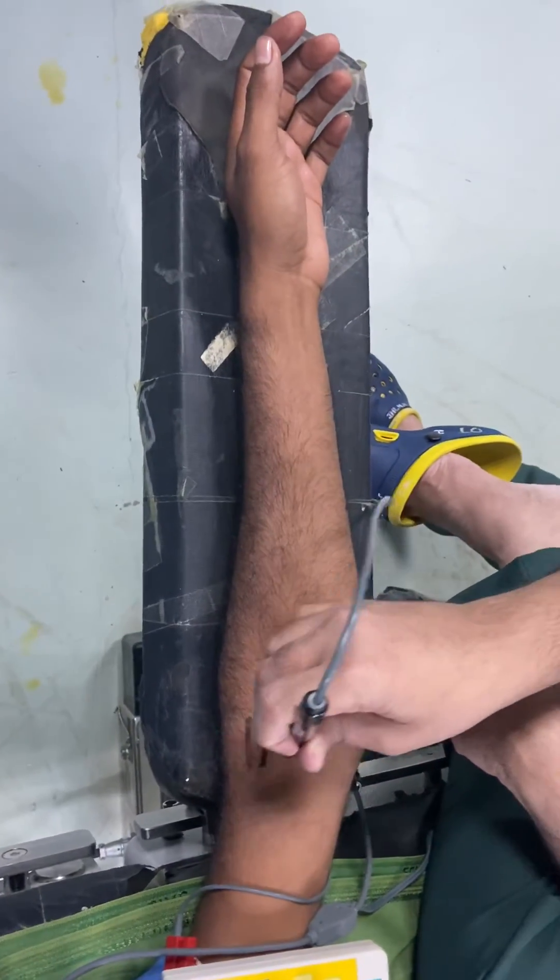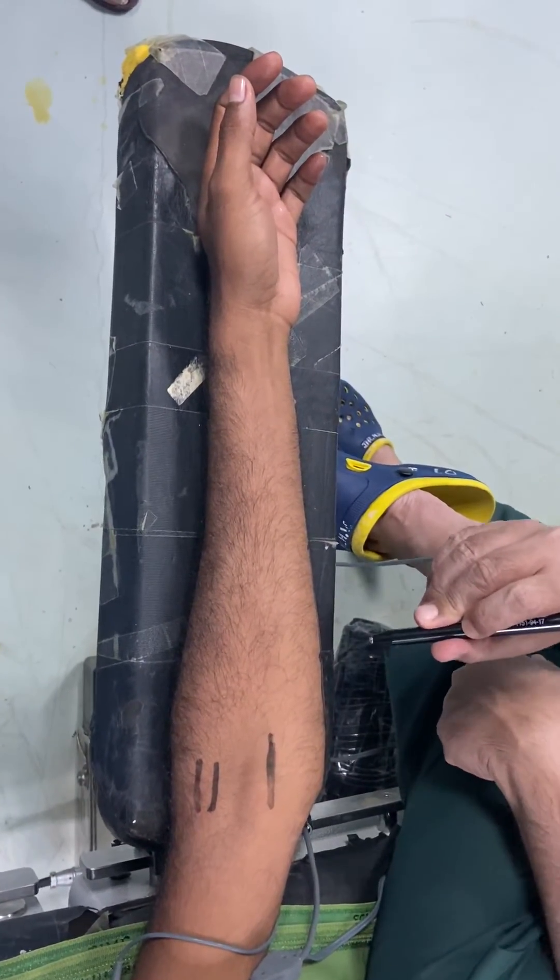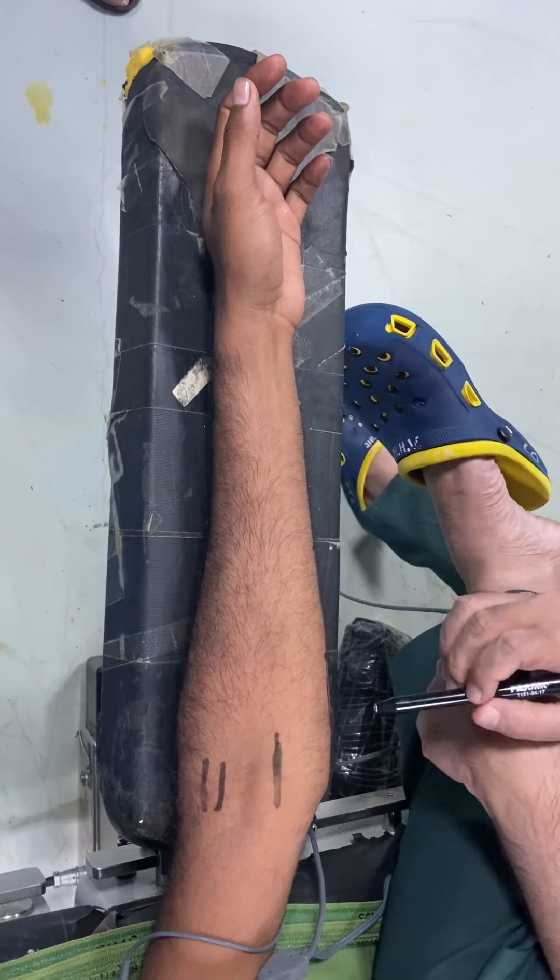So to summarize: median nerve at the elbow, radial nerve at the elbow, and ulnar nerve just below the elbow. This is how you can perform these distal nerve blocks. Thank you.